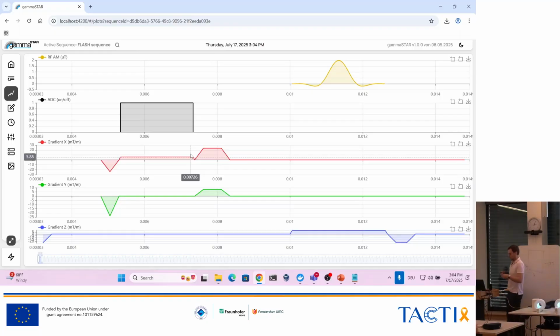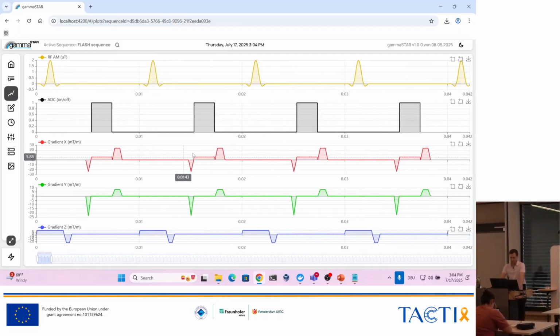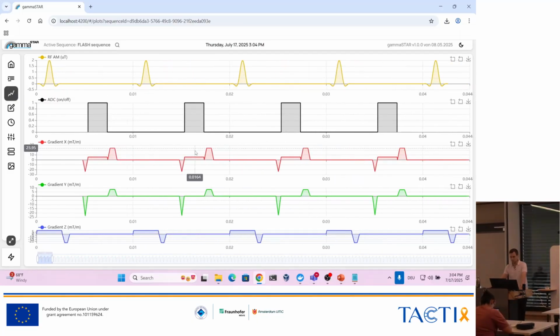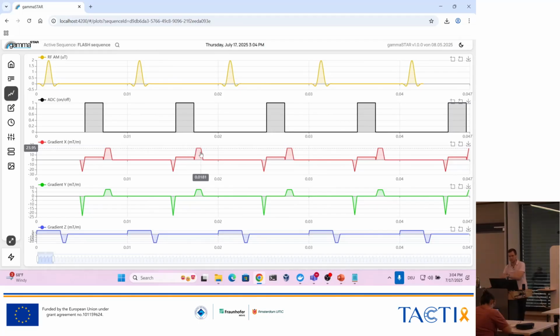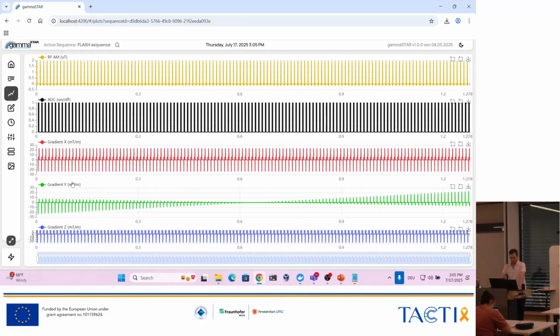So the actual data being read out by the MR system is exactly this data we're traveling through K-space. And as you see, this sequence is not very exciting because we do that over and over and over again. And you see that only one part of the sequence is changing. The part that is changing is this gradient in Y direction. And that's what you see tomorrow a bit more.